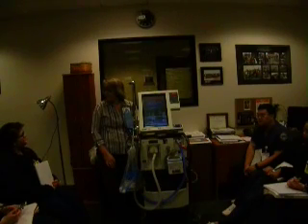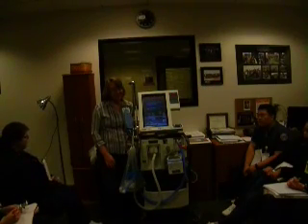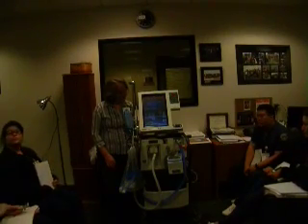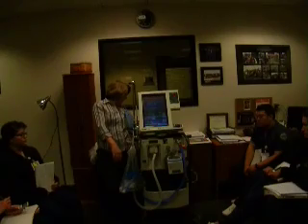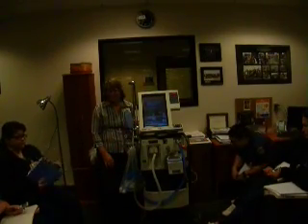So, questions? I'm sure you could find everything. It's just knowing what to put in there. Yeah. That's what you need to learn. Well, actually, it's hard to learn how to find everything when you've not worked with it before, too. So, you're going to learn what to put where, but you need to learn how to get around it as well. So, that's kind of a basic overview on how to get around this ventilator and where everything is. There's not really anything about the back you need to know. So, questions?